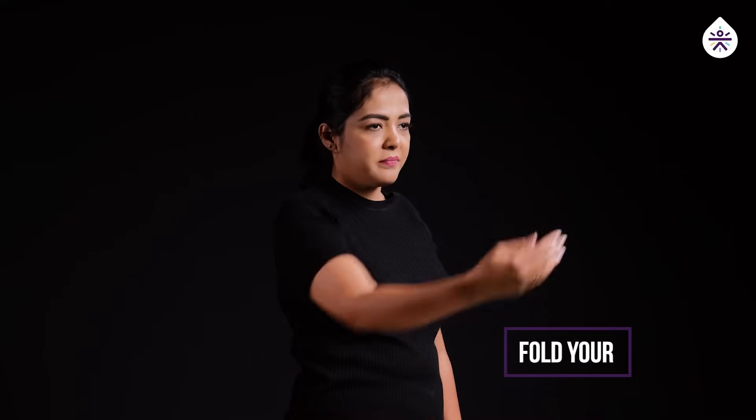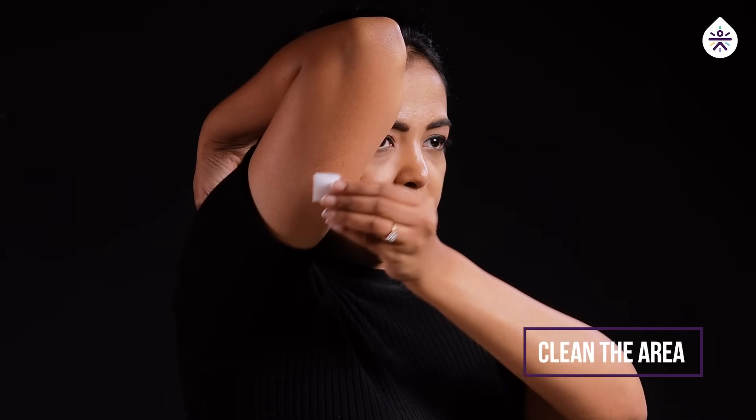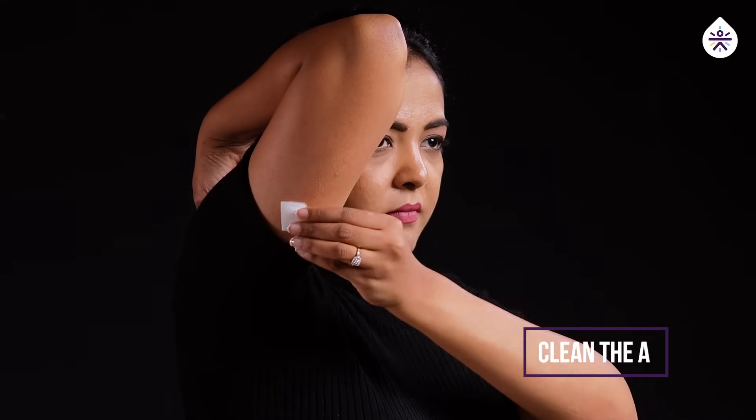CGM must be applied to the back of your arm. Let's start by folding your arm like this. Now clean the surface with wet wipes and let it dry for five seconds.